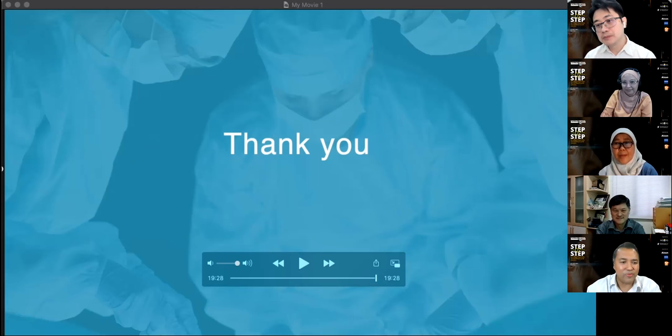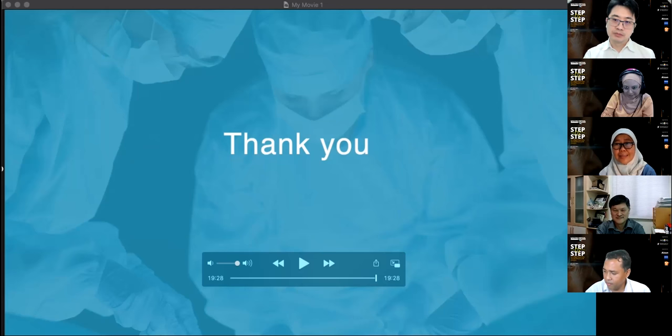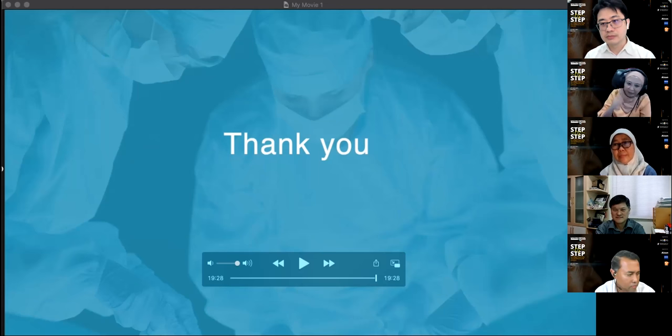Okay. Thank you. Moksha, I just want to ask you, the trocar-assisted Yamane is very interesting. At the end, the IOL will be placed, it will be fixed at the trocar site? Yes, supposedly. But of course, you don't put it at the usual trocar position we use for vitrectomy, about 3 to 4 millimeters behind the limbus. If we intend to do this, we just have to move the position. Yes, correct, at 2 millimeters.